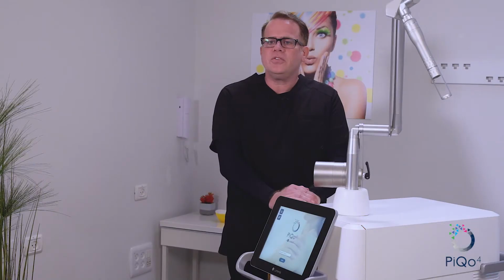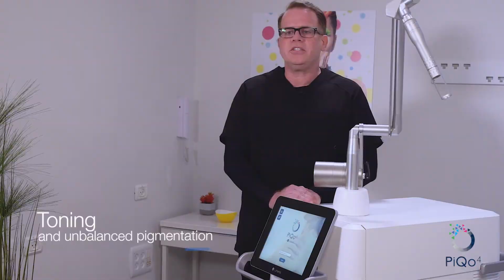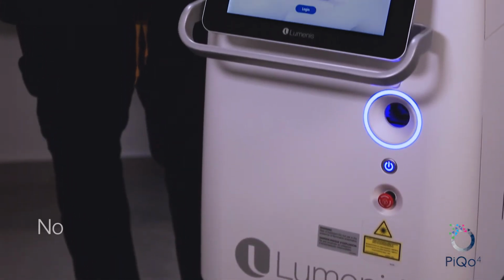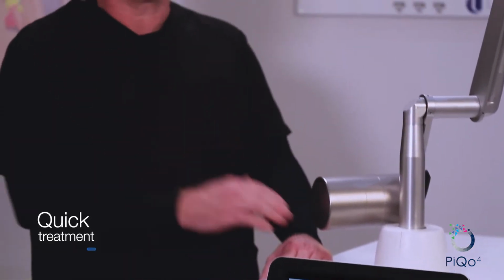The indications for use are for skin resurfacing, rejuvenation, skin textural changes, toning and unbalanced pigmentation, and pore size reduction. The benefits are that it's a non-thermal procedure that allows us to address all skin types safely. There's no need for topical anesthesia, there's no need for downtime, it's a quick treatment, and it can be used as part of a treatment combination with our other treatment modalities.